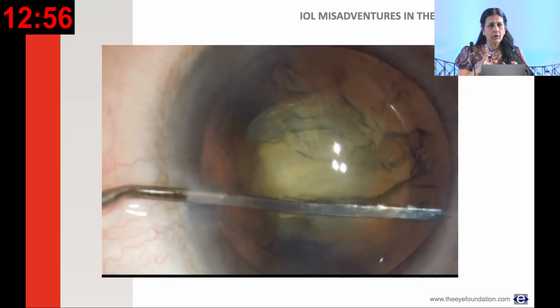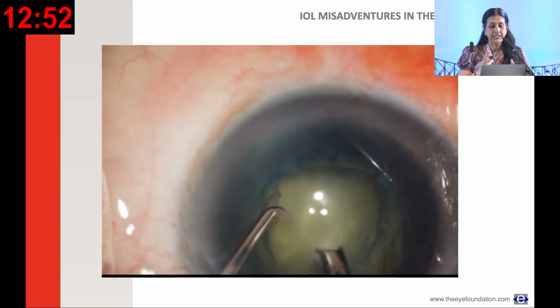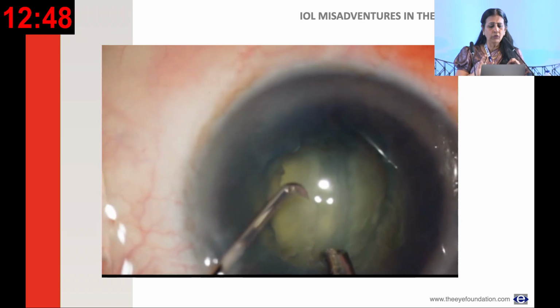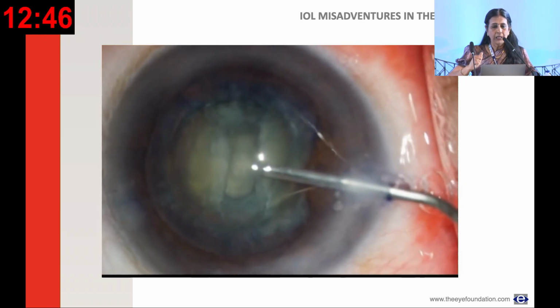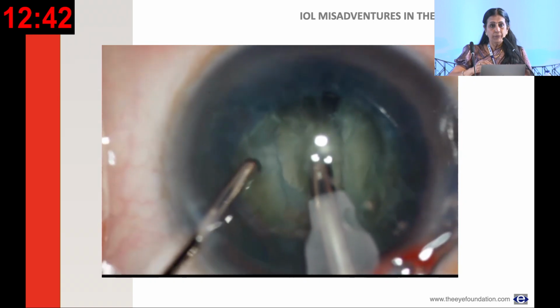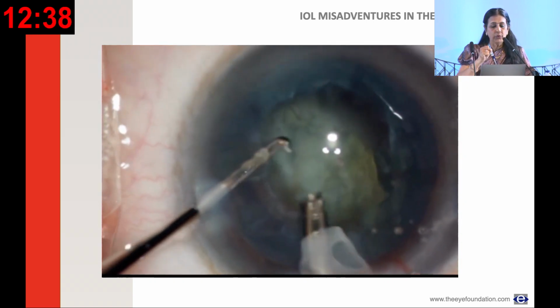It's most important that the hydrostatic pressure in the bag is retained. So every time you get an instrument in and out, or make any movement, the parameters need to be low. Keep injecting viscoelastic, and don't allow the anterior chamber to shallow, because that weak posterior capsule can give way. Then get that endonucleus out.